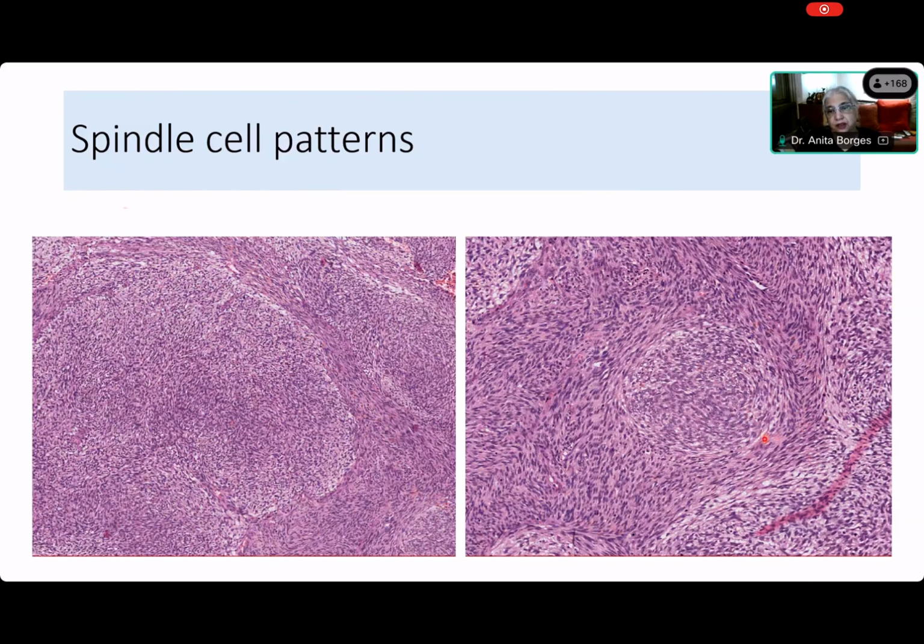Very good. Now, what about the other stuff? Priyamada, what about this huge big thing here? What about all the rest of this? Are they spindle cells? Ma'am, these look like spindle cells only, ma'am. A herringbone pattern is also there, I think. Herringbone. Where is the herringbone? You see a spine and you see things going off at an angle?